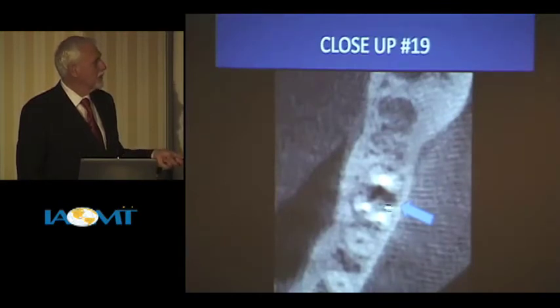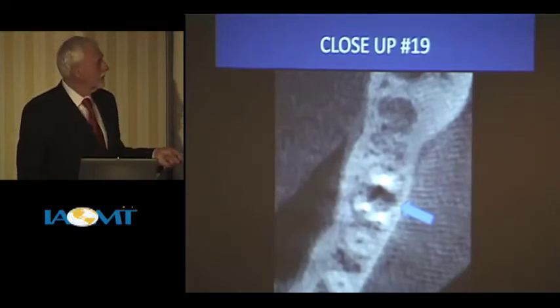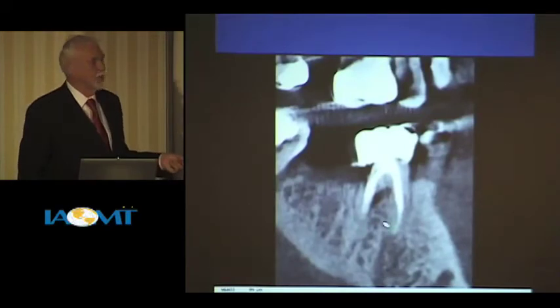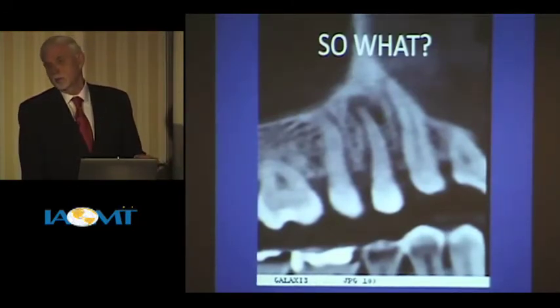And this patient had another, this is 19, obviously this is not related to the upper sinus. When I say that, it doesn't appear to be. This is a tangential view of the same thing. And there's nothing that says that the root canal has to fail down here, right? We've all seen that. All right, big lesion.